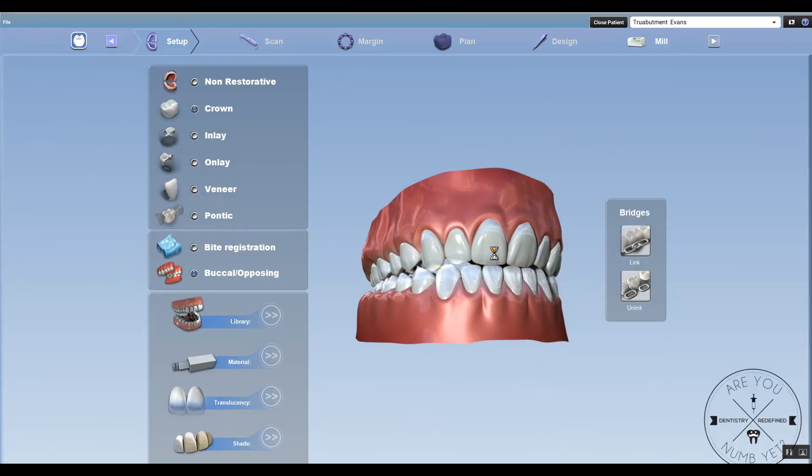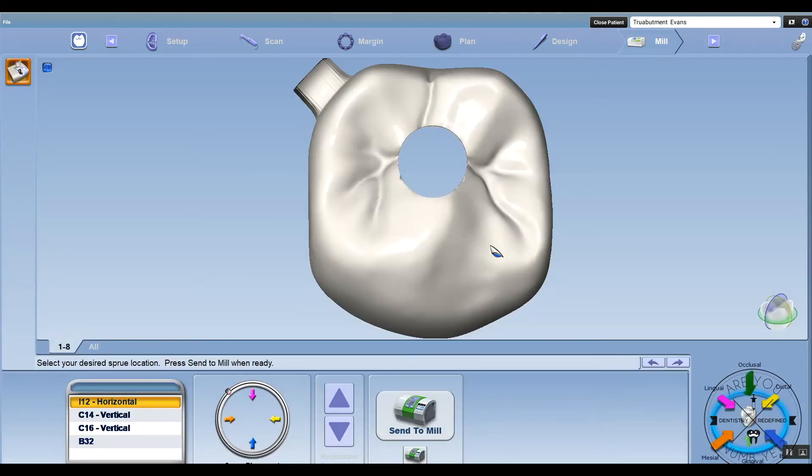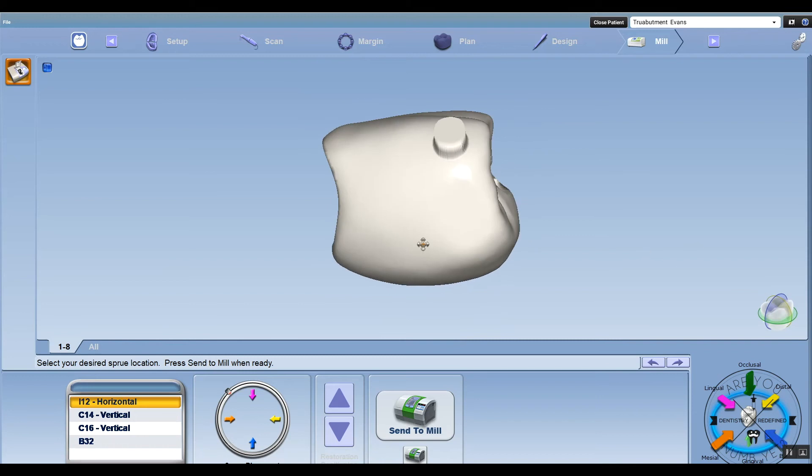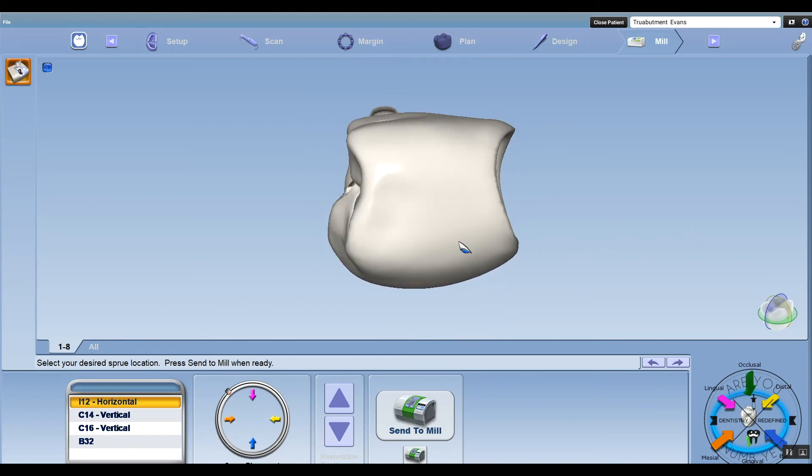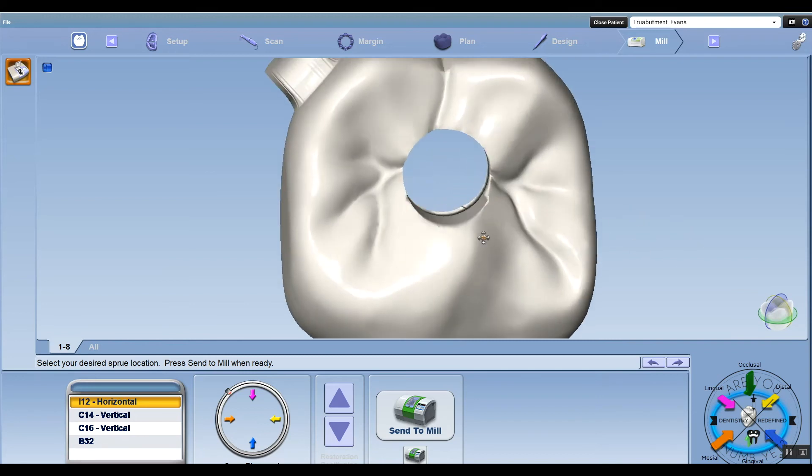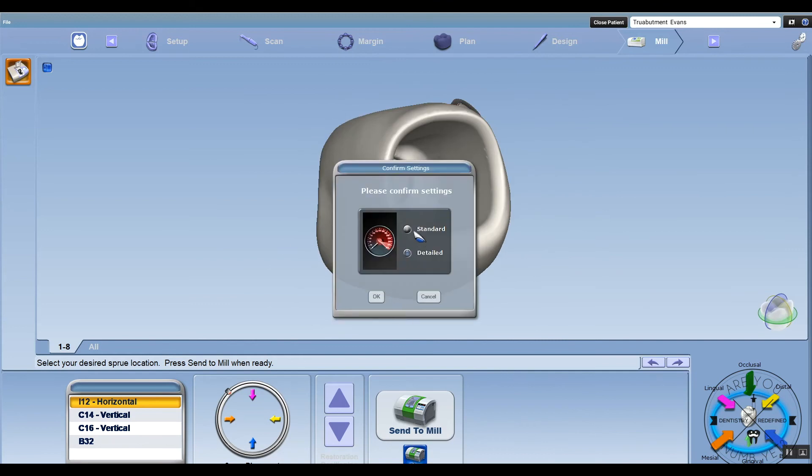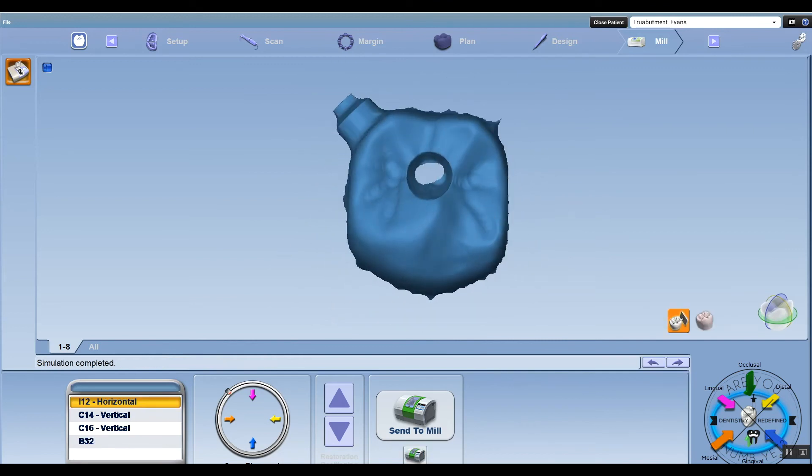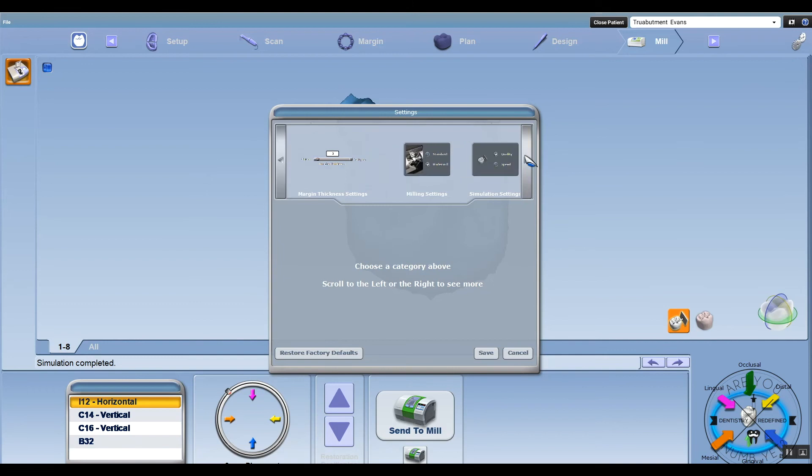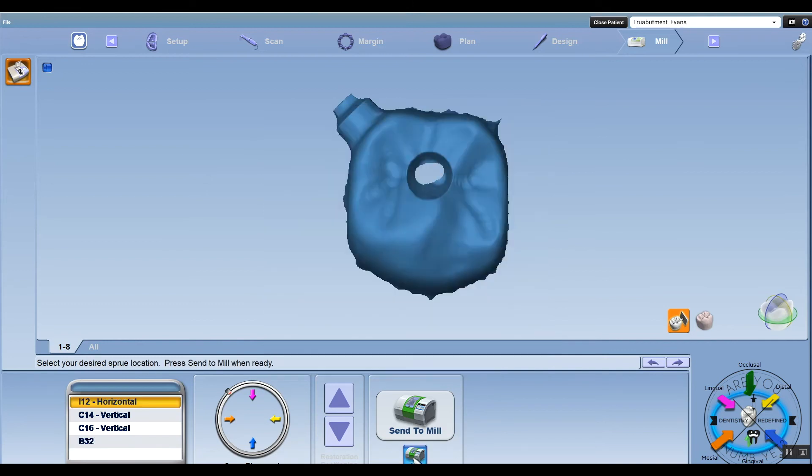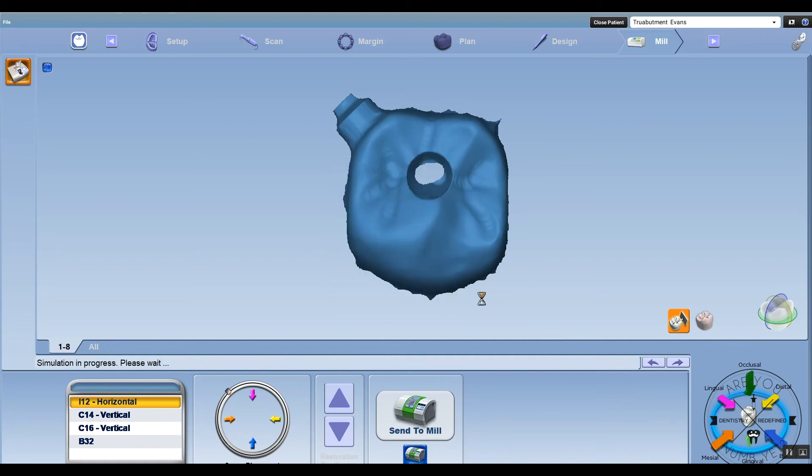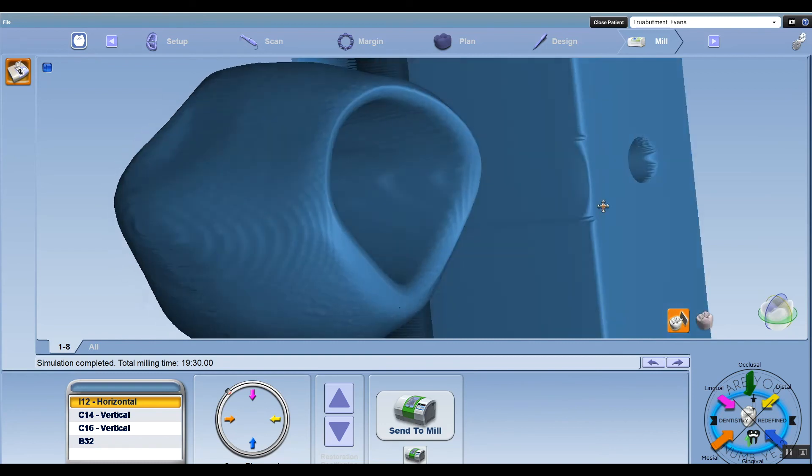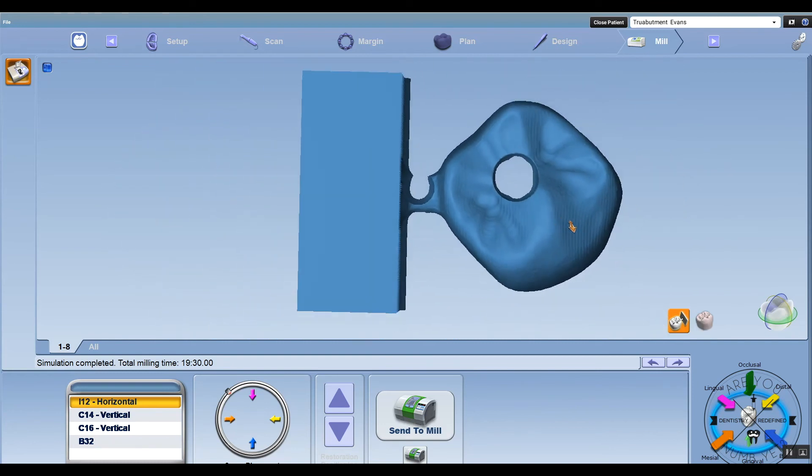Once you import that in, you're basically just going to go straight to the mill tab. It automatically takes you there. You're going to do a couple simulations to check everything. We're looking really good, a really crisp and clean file here. You could do a quick sim, but it doesn't really tell you too much. Go up to the settings and change your sim speed to quality.